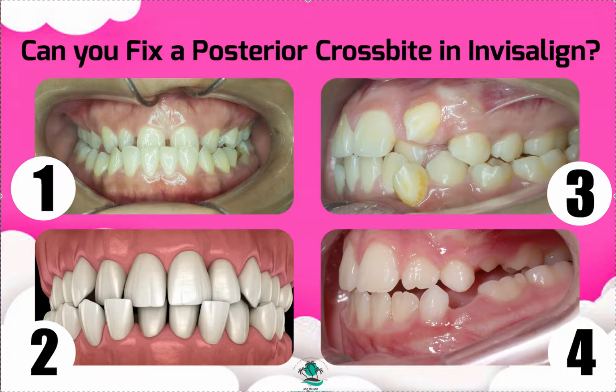And unfortunately, keep in mind with Invisalign, the default is going to be don't fix posterior crossbites. That is in your clinical preferences. Now, some people have undefaulted that, but that should be your default unless you've changed that. So your posterior crossbite shouldn't come fixed. However, if you've overridden the preferences or you have things in the comment section, you might find that indeed they try to fix it, or you might tell them to fix it.